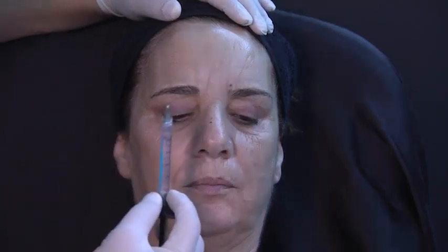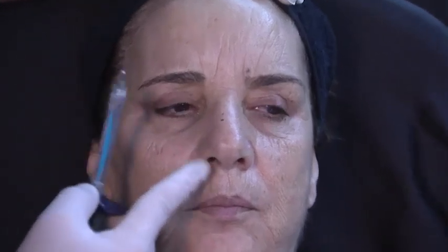Right, so I want you, because you have now the bone structure, once we've done this mid-phase treatment, of course we would love to do this, but this is surgical, okay? But now once we have improved from the mid-phase, we can now achieve directly the nasolabial fold. So now I'm going to use a product, and again I have 2 options, either Restylane Define or Refine. Because she has a deep fossa, piriform fossa, I have chosen my product on green, which is Define.